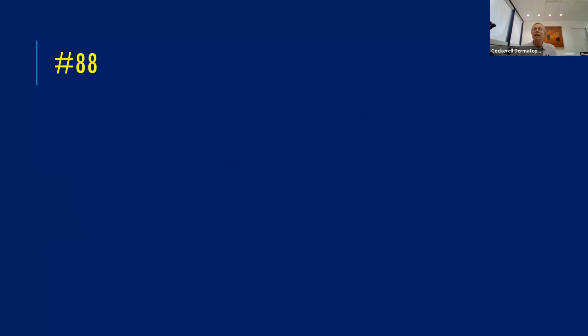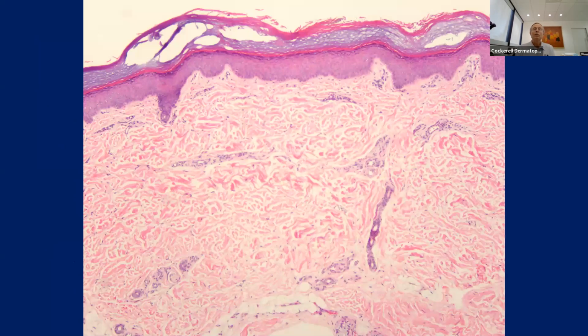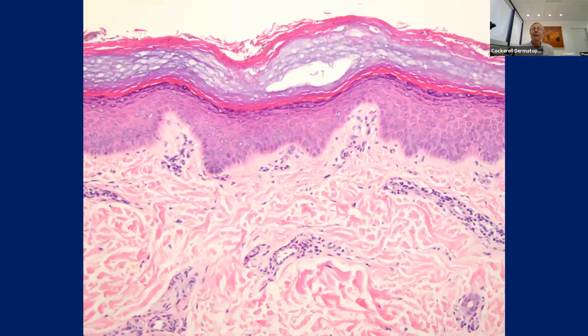Okay, this is another one. You had to have sharp eyes. So the biopsy looks like a nothing at low power. So we go to our nothing differential diagnosis. So you have that, hopefully. Start thinking about, well, gosh, what part of the body are we on? That's helpful. Near volar skin. And then somebody said tinea nigra. That's very good because that happens to be the right answer.